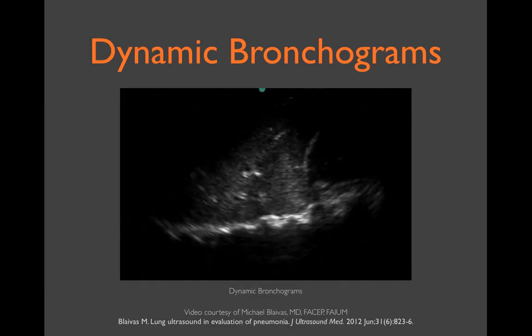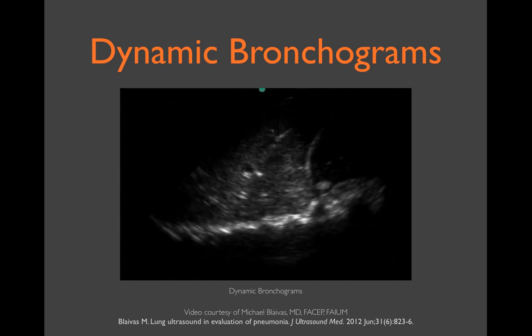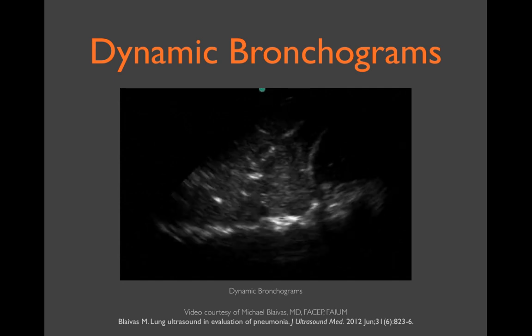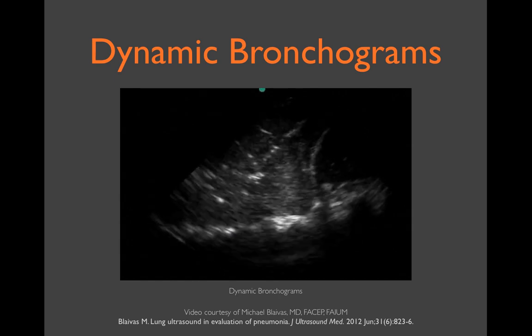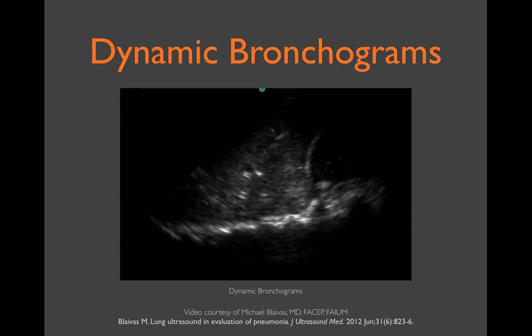These are sonographic air bronchograms, where small amounts of air remain trapped in air passages. Sometimes air and fluid may be seen moving within these passages. These are dynamic bronchograms, which increases the specificity for an infectious process versus atelectasis, the most common imitator of pneumonia.